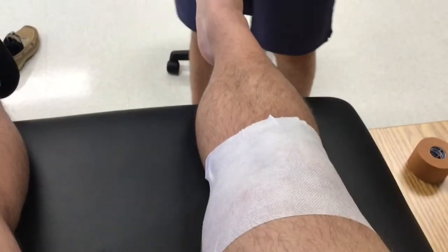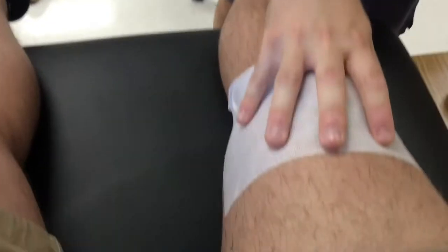Okay. All right. So Marcus has come back in here again. This time he's got some anterior knee pain. So we're gonna focus on locking in the patella with the McConnell taping. I've already got my cover roll down here, 6-inch cover roll. We've covered his entire knee.